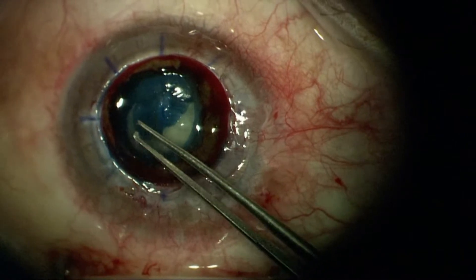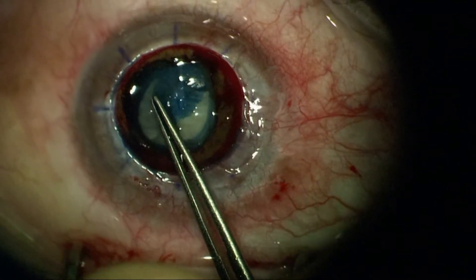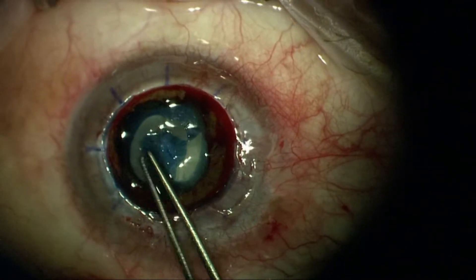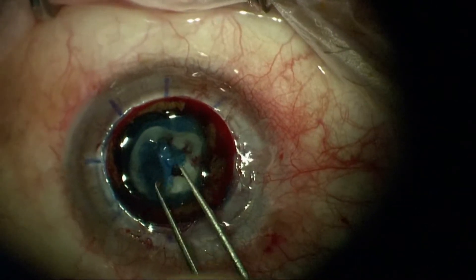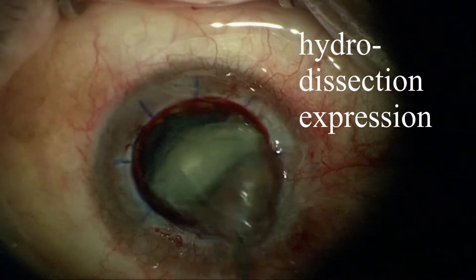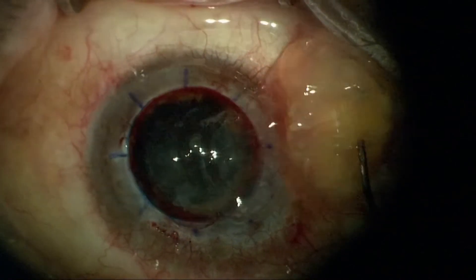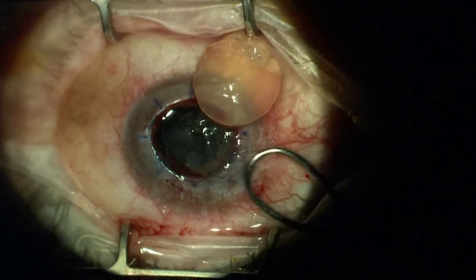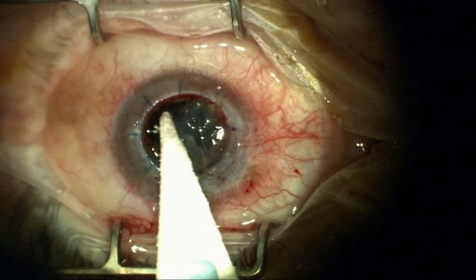I'm very gingerly removing the anterior portion of the capsule, striving to keep this relatively small. Behind this capsule you'll see a fairly intumescent lens with a dense nucleus that I'm managing first with a hydrodissection and then hydroexpression, with just additional manual expression using a lens loop to get the lens off the field. Then we'll address the residual cortex remaining.